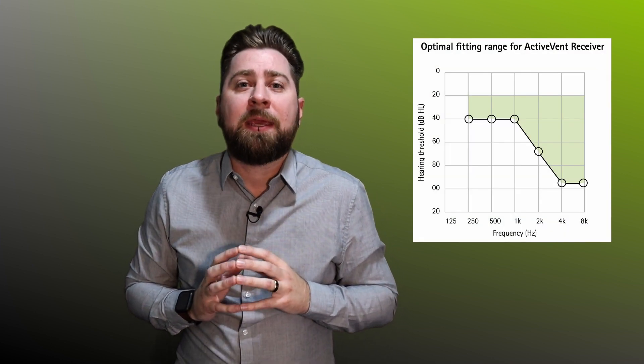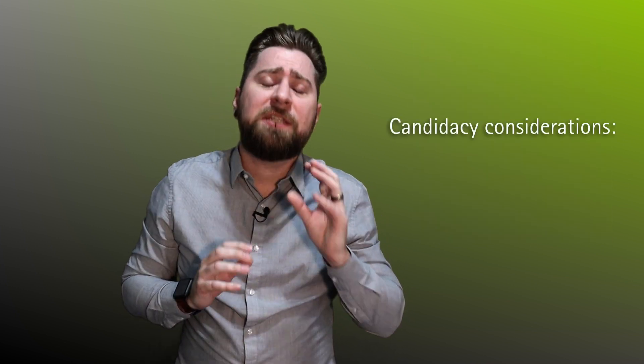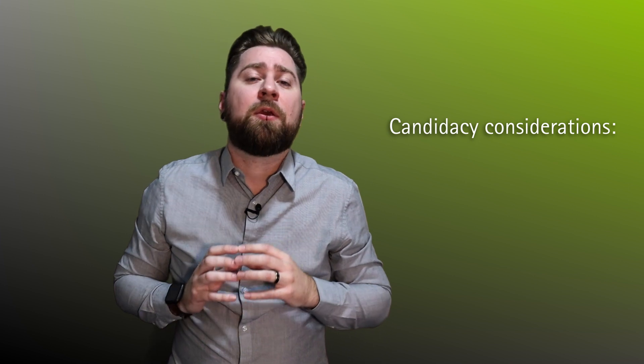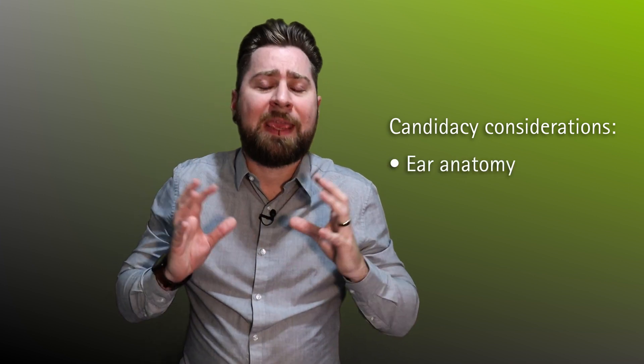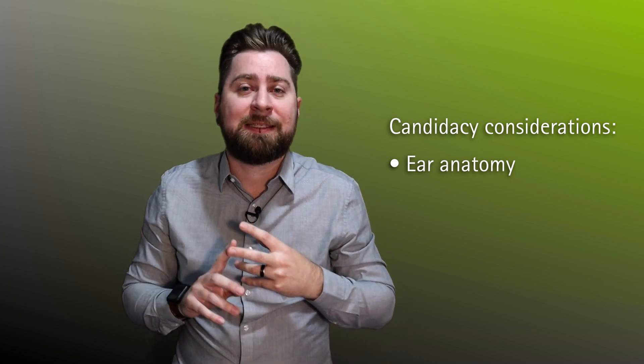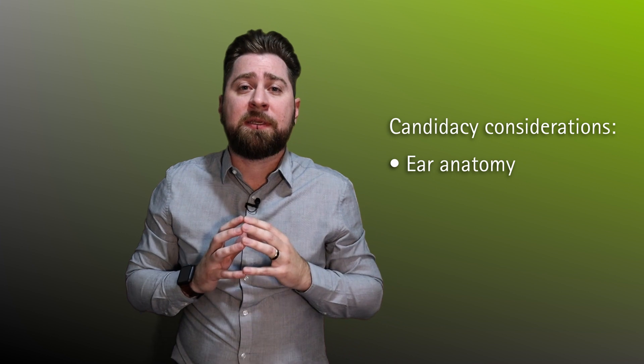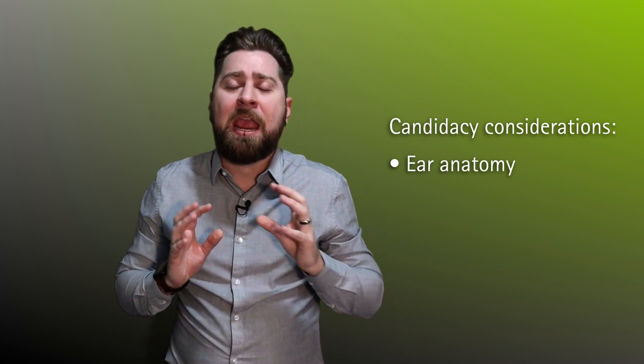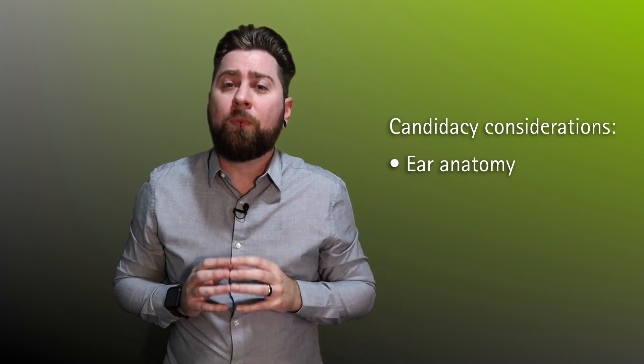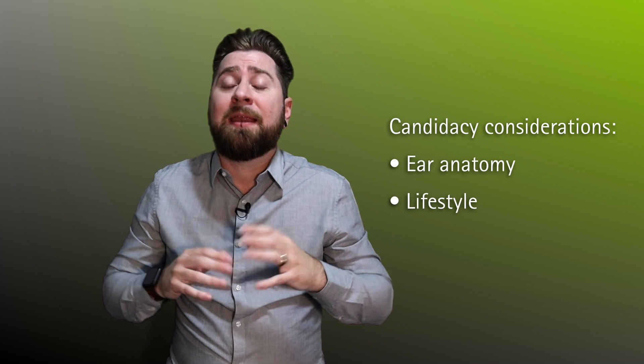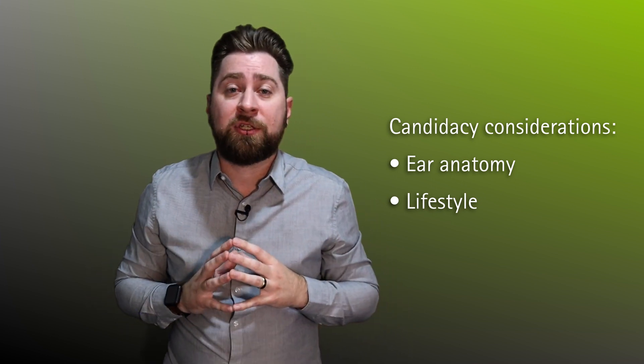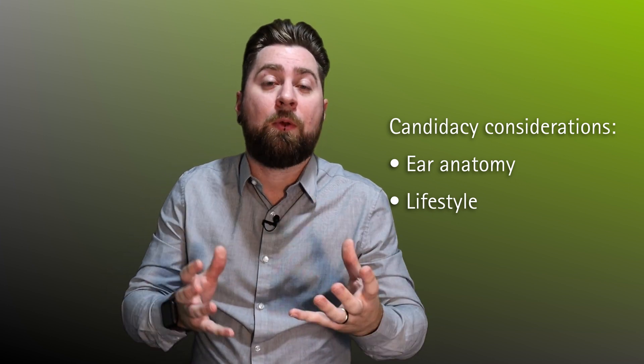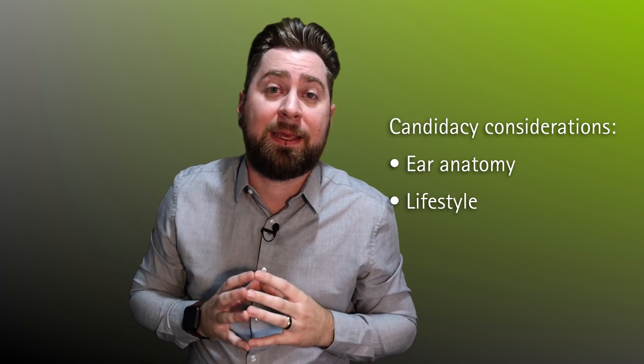It is important, however, to consider the ideal candidate for ActiveVent. The mild to moderate sloping high frequency hearing loss that we looked at earlier would be perfect. The audiogram shown on screen at the moment indicates the upper limits for fitting ActiveVent. Additional factors that should be taken into consideration include the ear anatomy and physiology, ensuring that the ear canal is large enough to accommodate the ActiveVent receiver along with the custom titanium slim tip. Further to this, the delicate function of the ActiveVent receiver can be adversely affected by excessive wax and moisture. Lifestyle factors are also important in that is your client often in challenging listening situations, or does technology and the ability to stream content wirelessly into their hearing devices play a large part in their life?